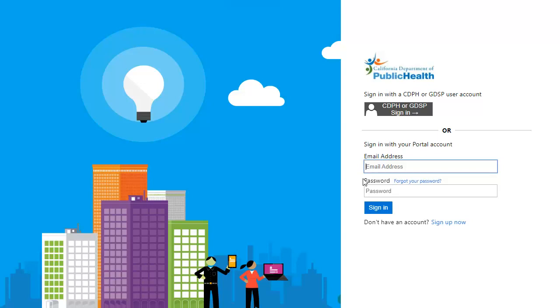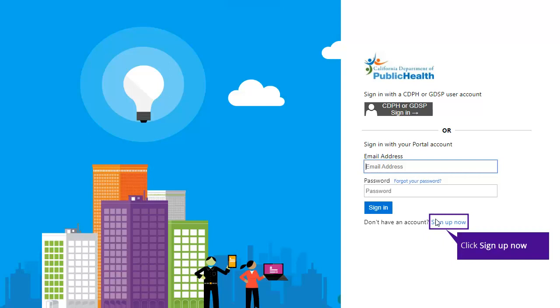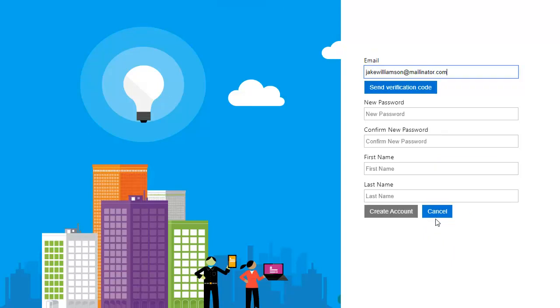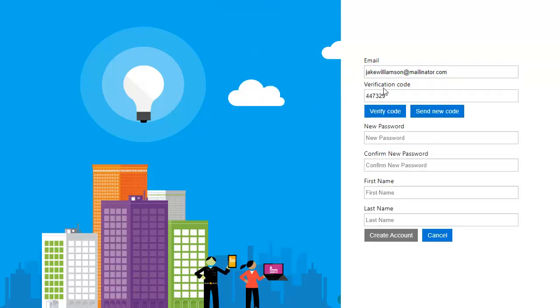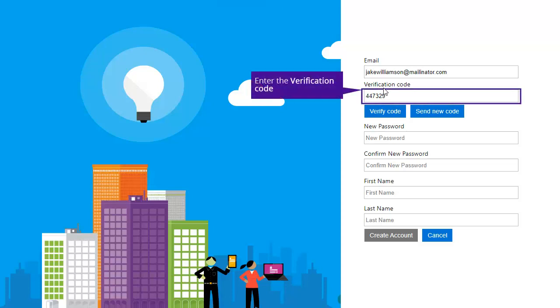On the login screen, click the Sign Up Now link under the login fields. On the new page, provide your email address and click Send Verification Code. Please wait for two to three minutes until you receive your code via email. Enter the code in the Verification Code field and click Verify Code.